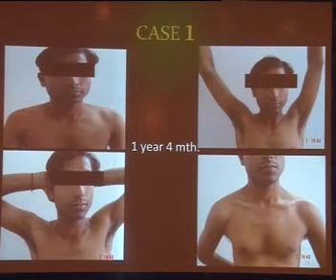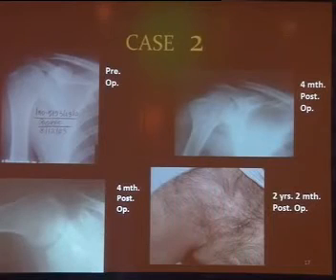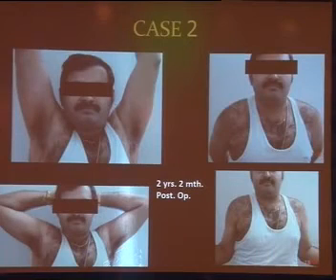He had a very good range of motion. Similarly, in another case, pre-op, 4 months follow-up, then 2 years of follow-up, and 2 years and 2 months of follow-up, again with a very good range of motion and a stable joint.